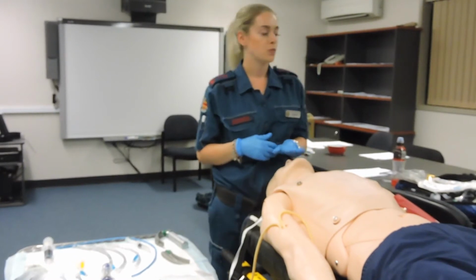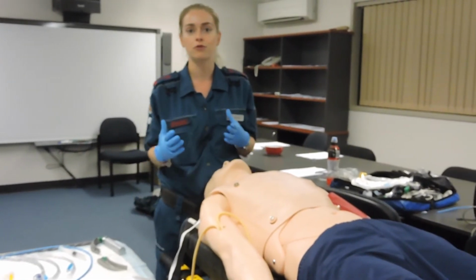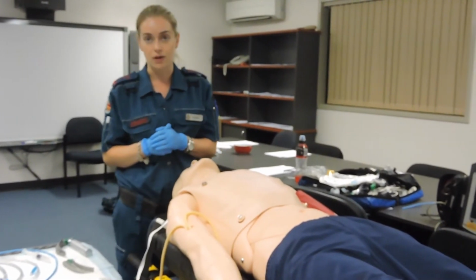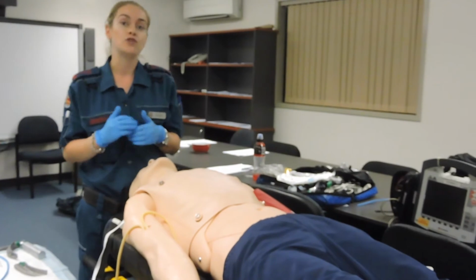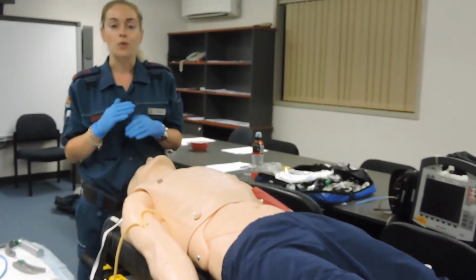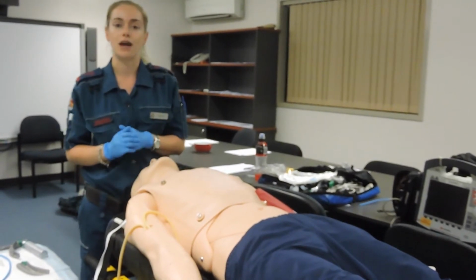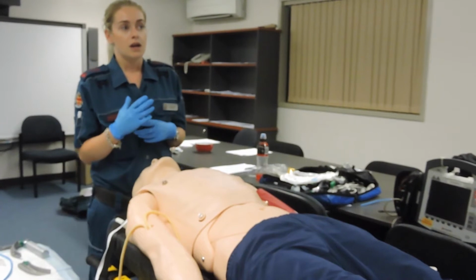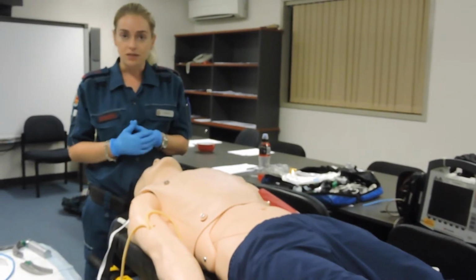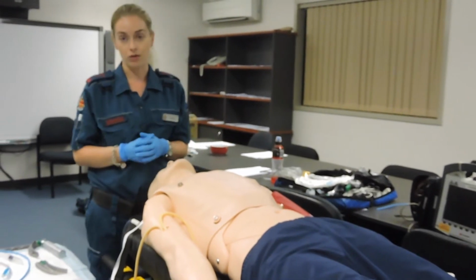Once we intubate the patient, we look at the monitor for CO2 waveforms. We're looking for 4 to 6 CO2 waveforms to tell us that we are in the correct location. If we do not get a CO2 waveform, or not the waveform that we are looking for, we stop, we remove the tube, and we go to our failed intubation algorithm. We also allow 30 seconds or 2 attempts of an intubation before we enter our fail algorithm.